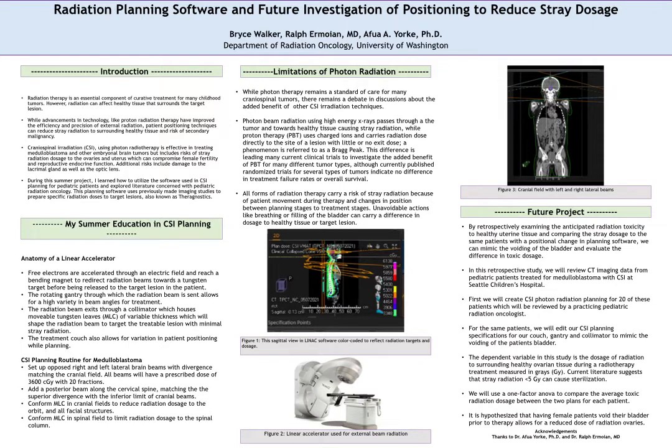I'm a second year at the Spokane campus for University of Washington School of Medicine. My summer project was based around a learning software which is used for radiation planning treatment. I worked with Dr. Afui York and Dr. Ralph Morian from their base at Seattle Children's, taking a look at pediatric patients, mostly with medulloblastoma.